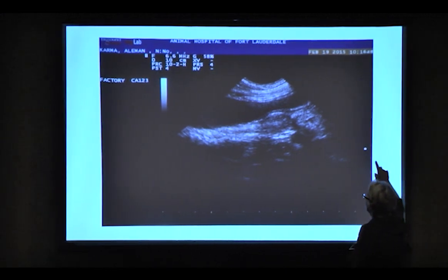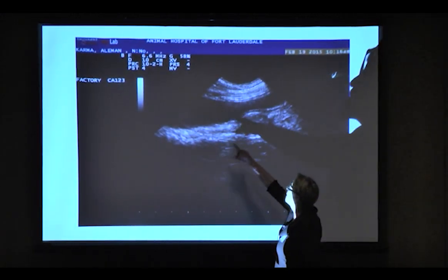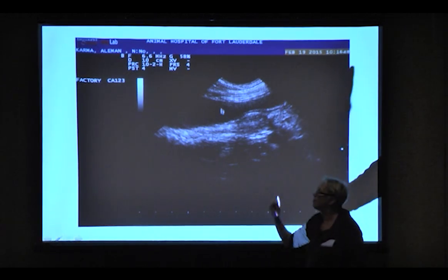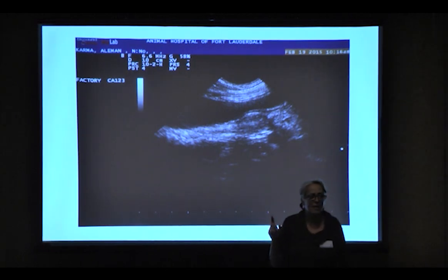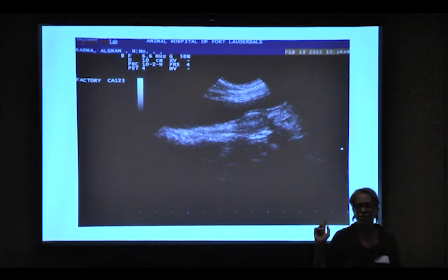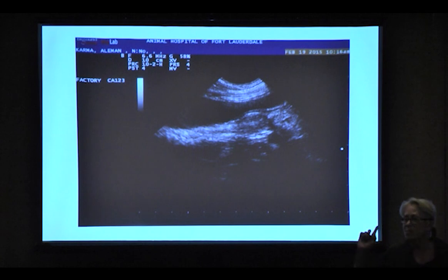Okay, so anyway, we do an ultrasound. And see this big black thing that's right there? Remember the black thing that had a little circle in it before? It was a puppy? That is a pyo. That is a pus-filled uterus. It was disgusting. Absolutely, positively disgusting.